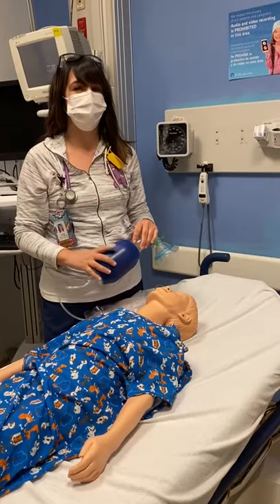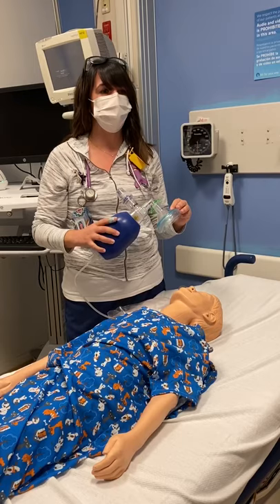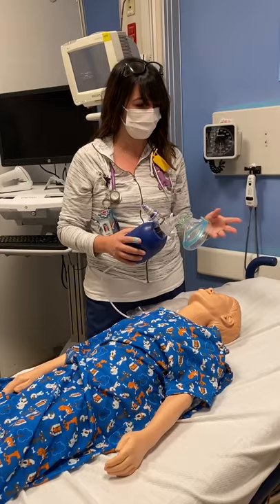Hi guys, my name is Natalie and I'm going to be talking about self-inflating bags. Self-inflating bags are also known as AMBU bags and BVM bag valve masks. It provides positive pressure ventilation to patients who aren't breathing or who aren't adequately breathing.